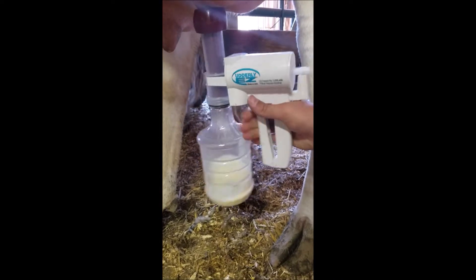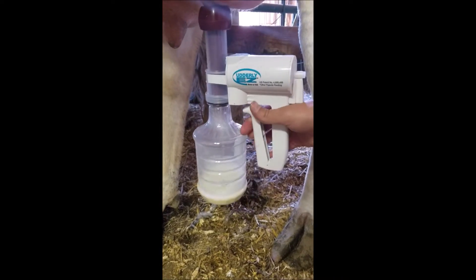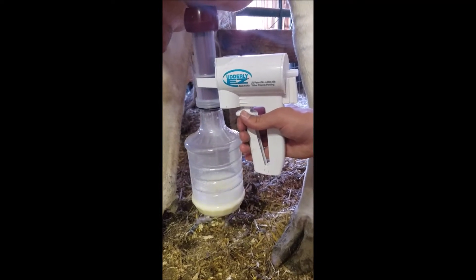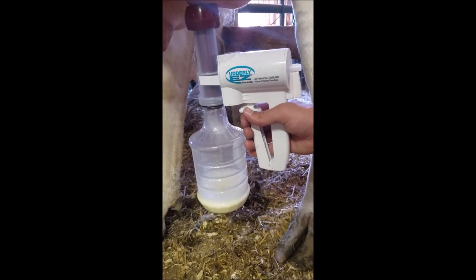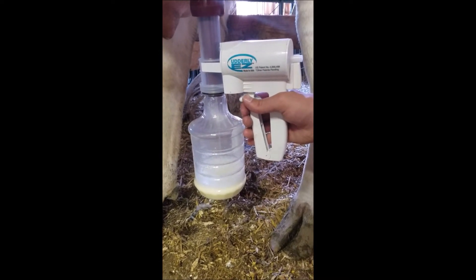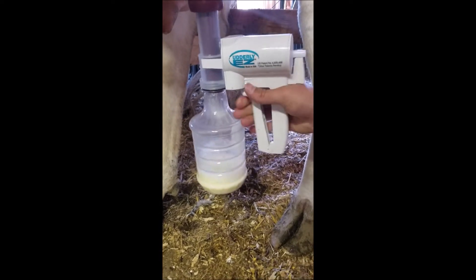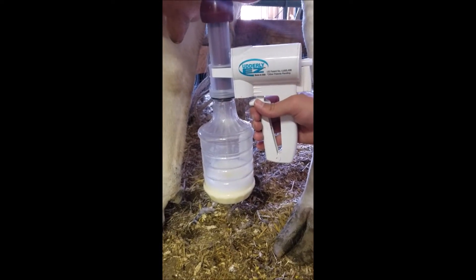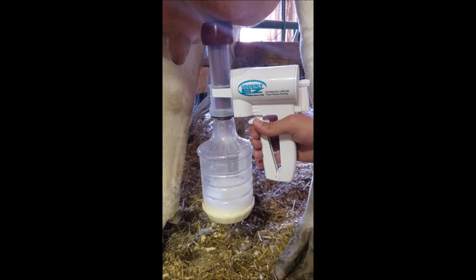Go ahead and pump it. Once the milk gets flowing, go ahead and stop pumping — it'll just keep going. You don't have to wait for it to stop. Just go ahead, and when it slows down a little bit, give it a couple more pumps, pick up the vacuum, and then let it sit there and watch the milk run. Working just like it's supposed to.